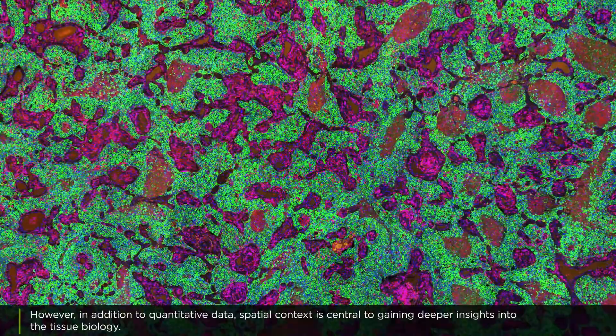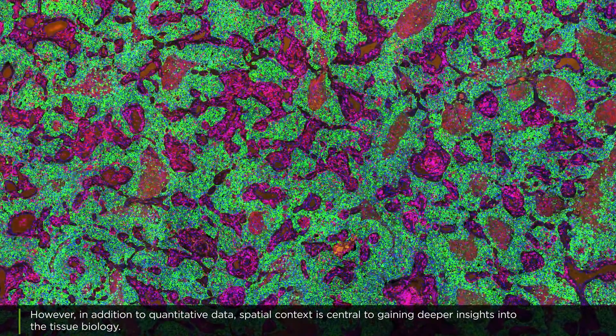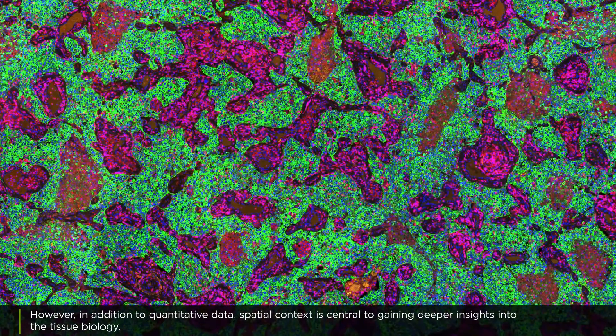However, in addition to quantitative data, spatial context is central to gaining deeper insights into the tissue biology.